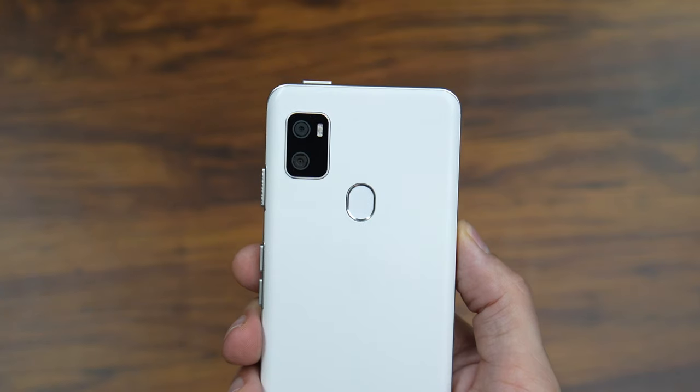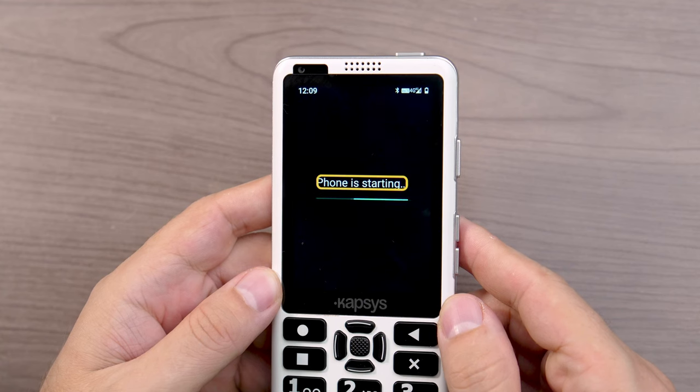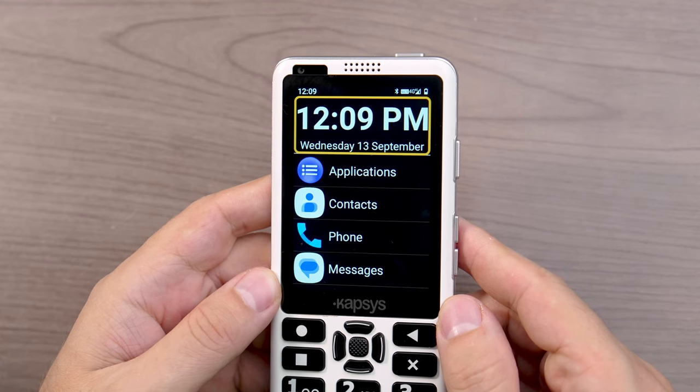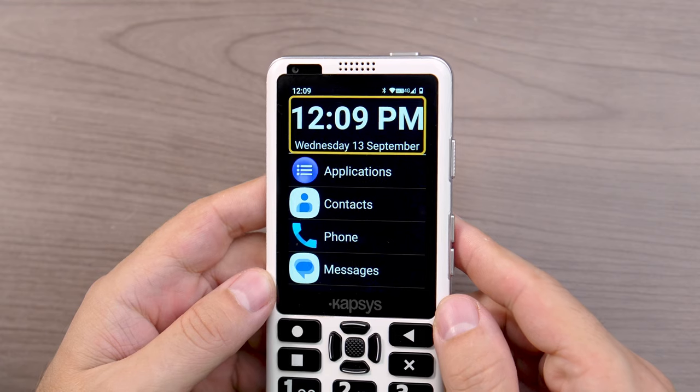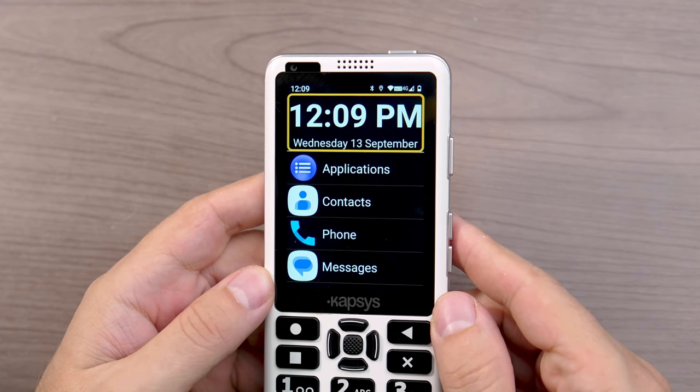Down along the bottom you have the USB Type-C charging port and a speaker grill. There's also a speaker grill above the touchscreen, so you should be able to get stereo audio when listening to things like audiobooks or music. On the back we have the cameras. Although the SmartVision 3 is running Android under the hood, you don't see it right away — when you first turn on the phone, you're presented with a unique accessible user interface.